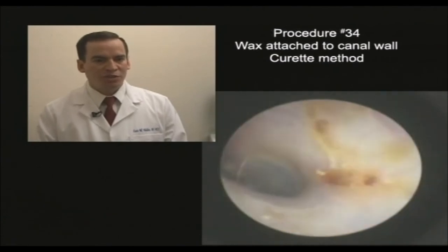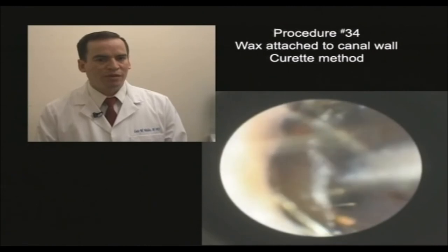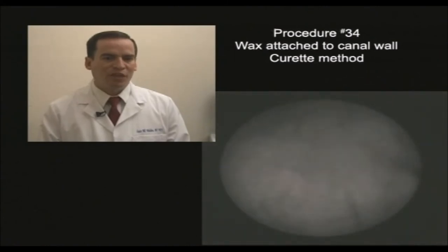Look at the edge — there's a little flap here. We're going behind it. Move a little bit back. Apply some pressure. It's loose. We're going to just pull, and we're actually tilting the whole thing out.